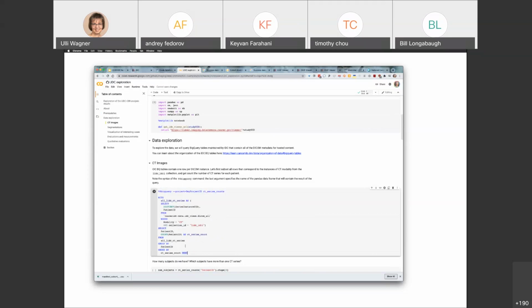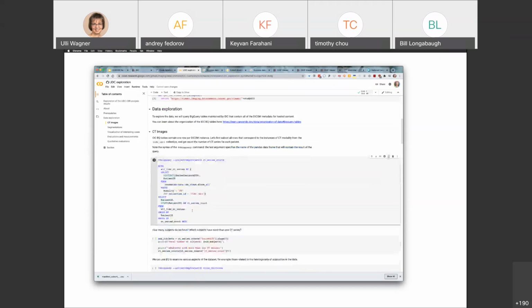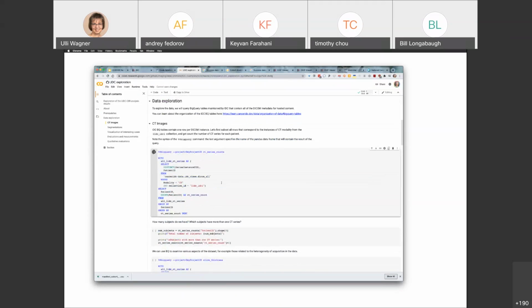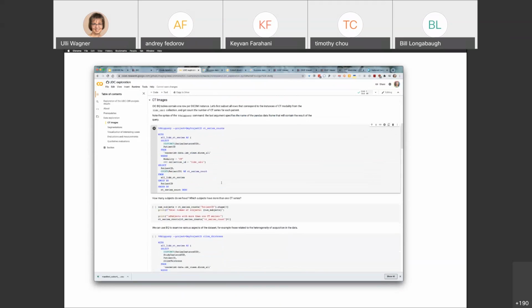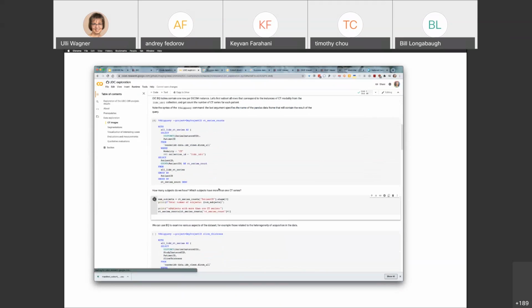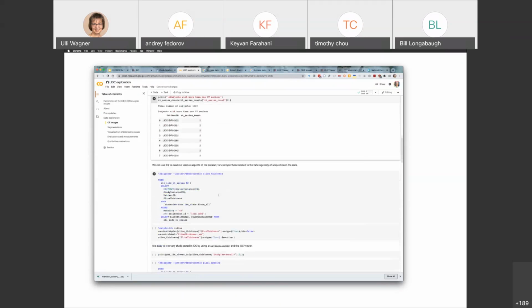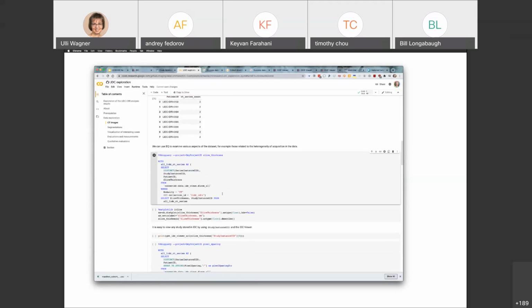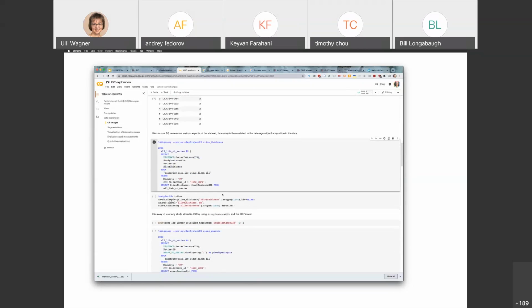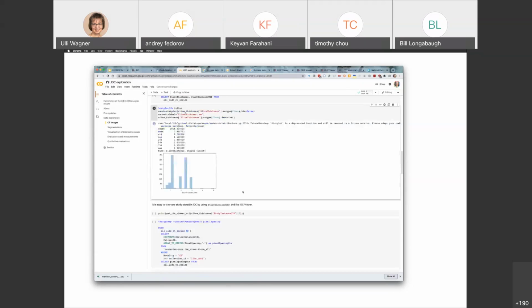I can use SQL style queries to query those various tables with the metadata that are publicly available and are maintained by IDC. So here, for example, I can query this table to get all of the counts for the CT images. So I can sort them and see how many CT series each case has. I can similarly query the table to explore certain attributes that are not available, for example, in the IDC portal, and explore that in this way.